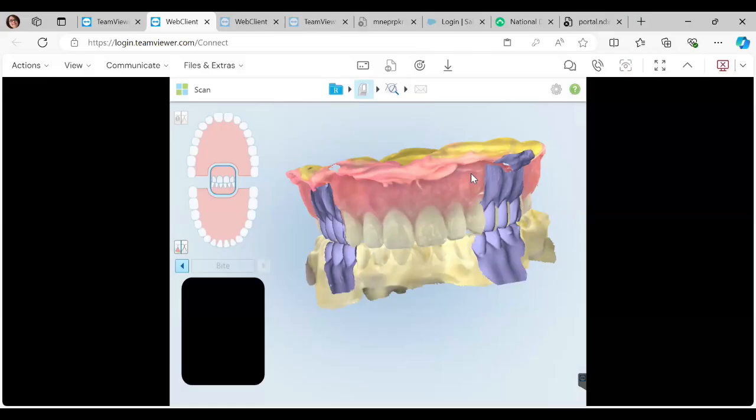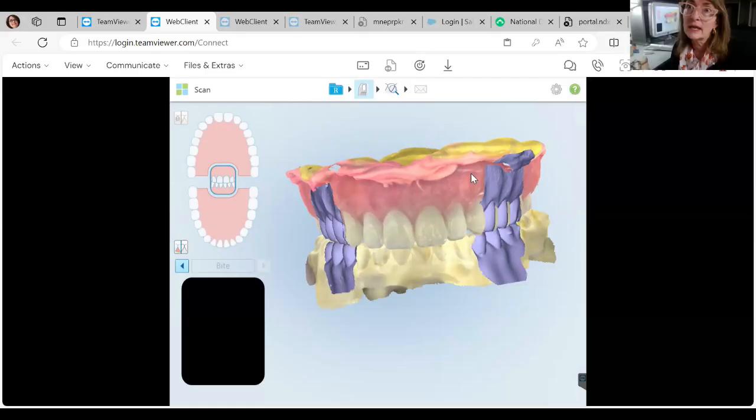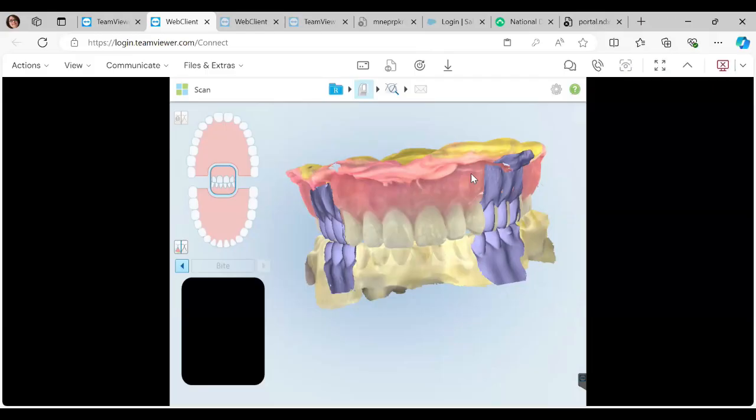And do you encourage turning the scanner off before completing the intaglio portion of the scan? So when I do the cameo, the tooth surface, I'm going to roll over to the intaglio just for maybe 3 seconds. And I turn it off to allow the processing of the data to begin. And then I start back on the intaglio. I hope that answered the question. Yes.